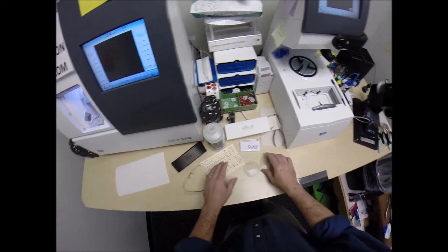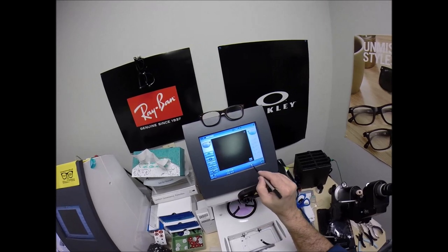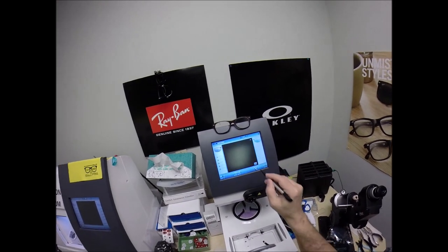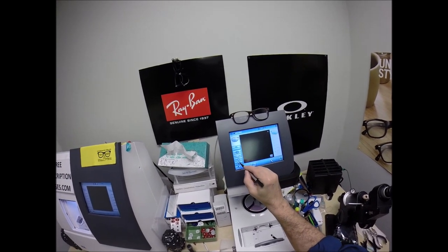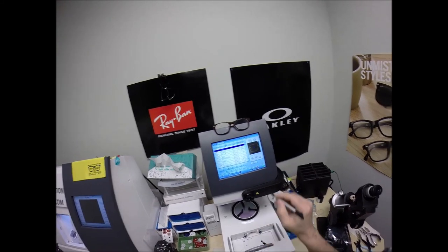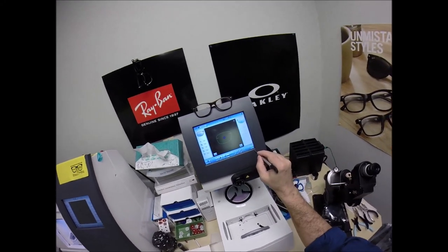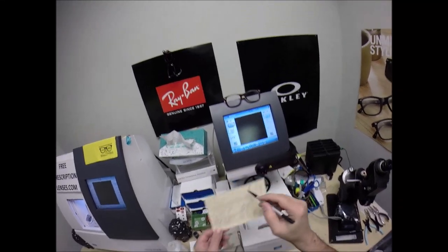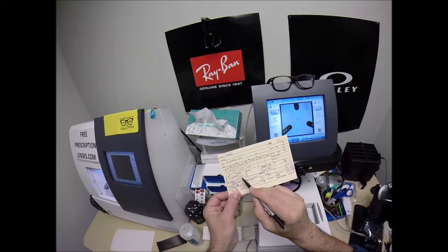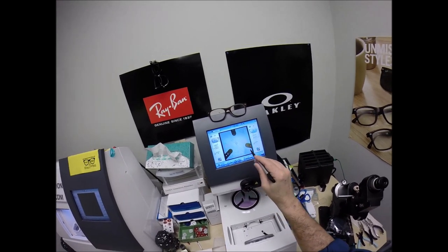I'm going to program this into the computer. The shape is 7610, size 50. I look through the file for 7610 size 50, and that shape comes up on the computer with the drill holes already aligned where they're supposed to be. The pupillary distance for the right eye is 35 — the computer had it at 32, so I go up to 35. The optical center height, the vertical decentration, will be 20 — that's where the invisible bifocal will sit.